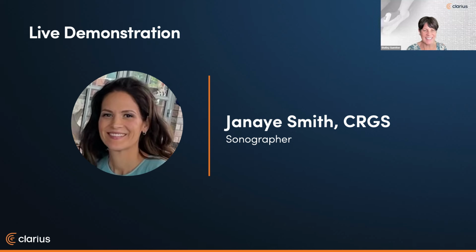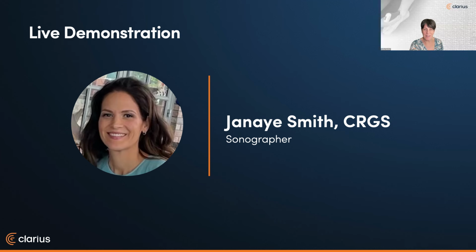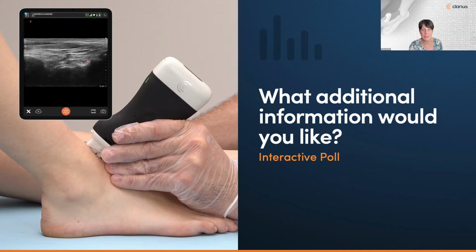Great. Nicely done, Janae. Thank you. Thanks. Right. Thanks to both of you, Janae and Mark, for your ultrasound protocols and best practices for imaging the foot and ankle.